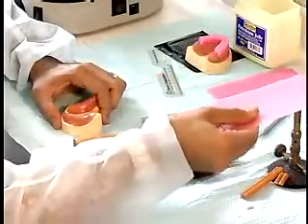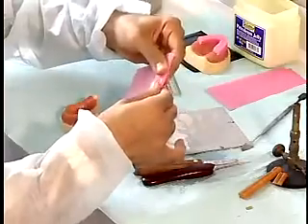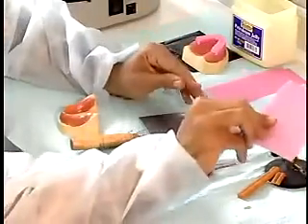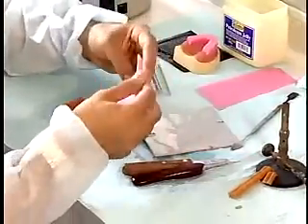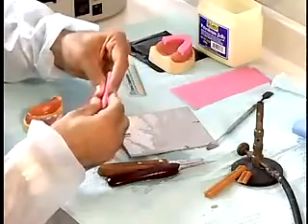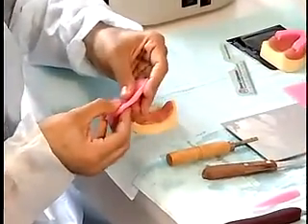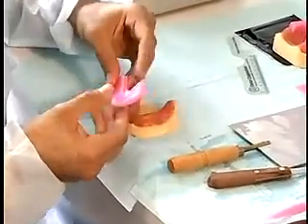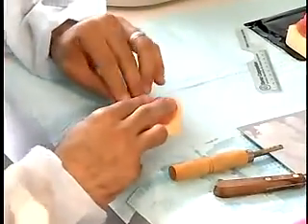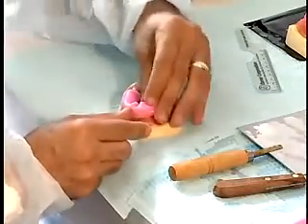Uniformly soften a sheet of hard pink baseplate wax. Flame the wax in a Bunsen burner flame slowly by passing the wax quickly through the flame many times. When the wax is thoroughly softened, fold the wax. Continue to flame the wax to soften it. Repeat the folding and warming until the entire sheet of wax is used. Form the wax into a horseshoe shape and adapt the wax to the record base.